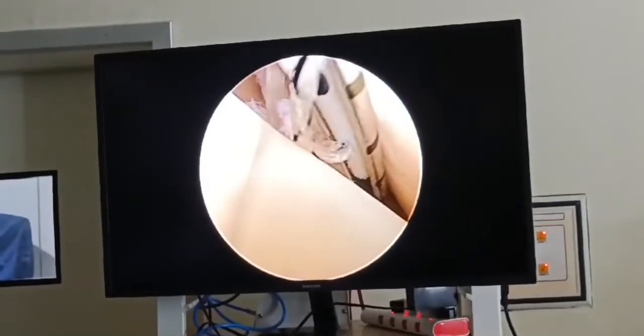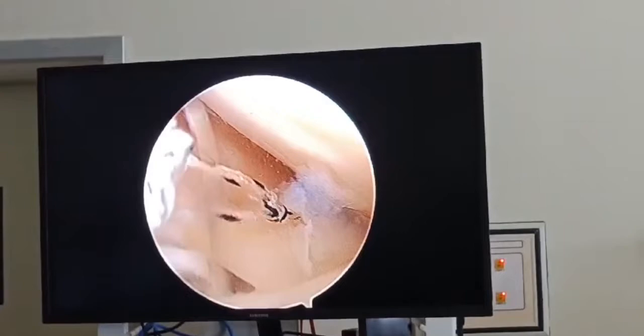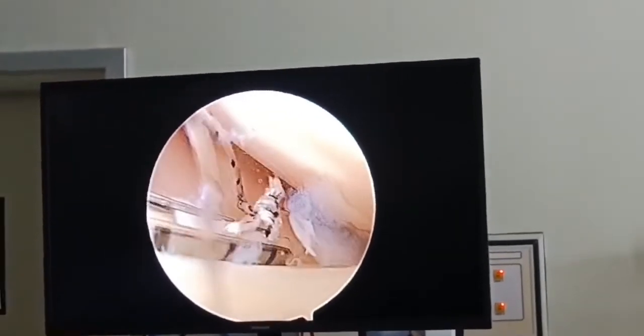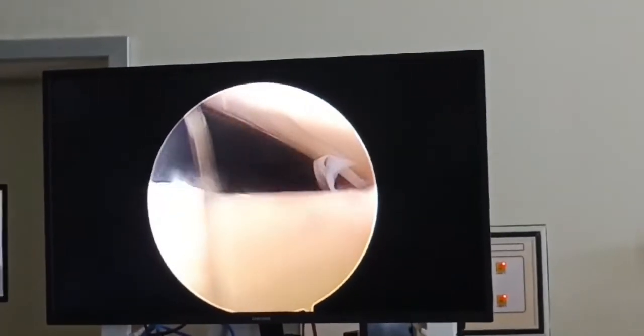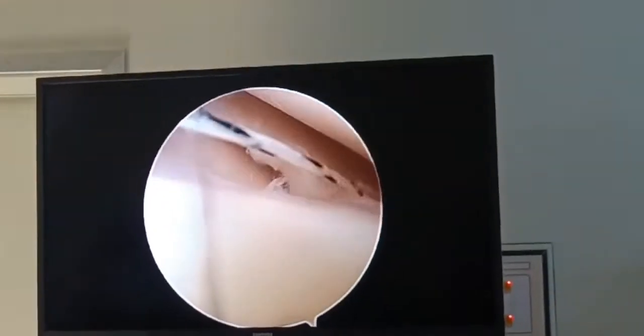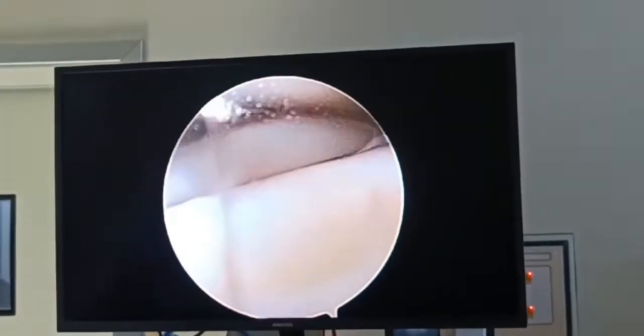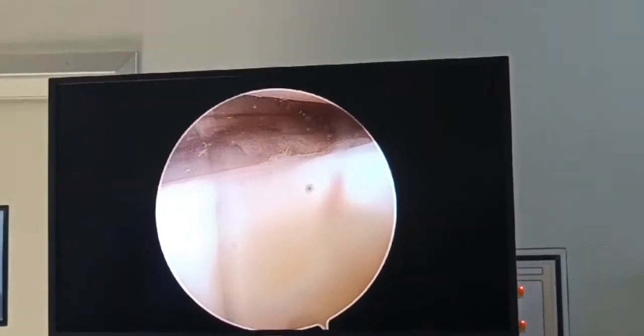We then close the rent using a pre-loaded meniscus suture anchor. Here I am using Cironix's SureStitch, which has a pre-loaded anchor and pre-loaded knot. It has two implants; I use it to deploy, suture it tight, close the rent, and then cut the suture out.